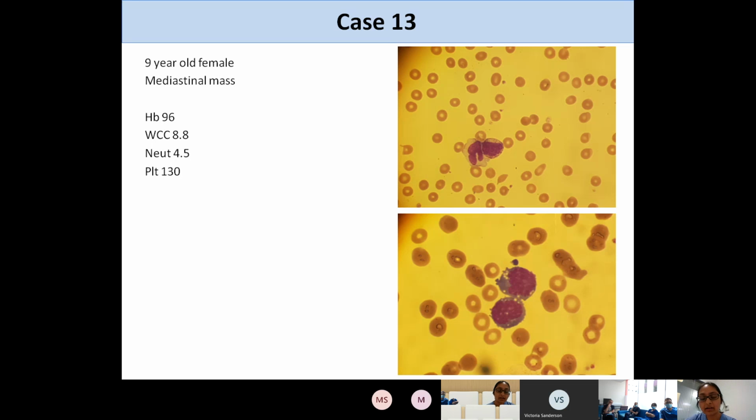But when we did her bone marrow, she had these large blue blasts in her marrow. So these are, again, huge. There's a high nuclear to cytoplasmic ratio, but there's still some cytoplasm present. And the cytoplasm is intensely blue with multiple vacuoles. So these little vacuoles here.